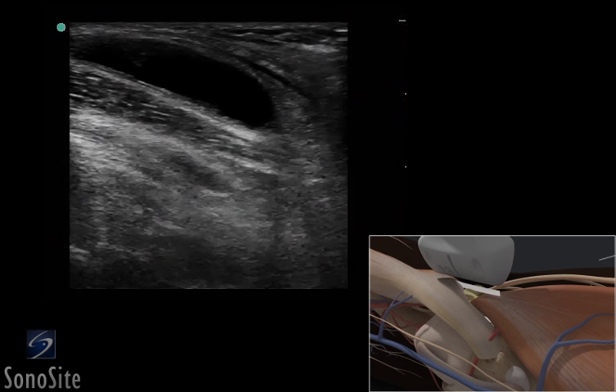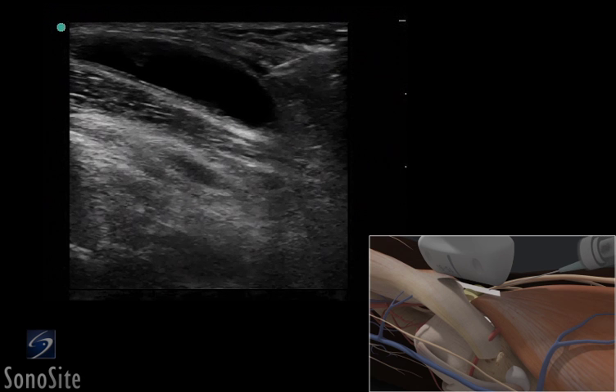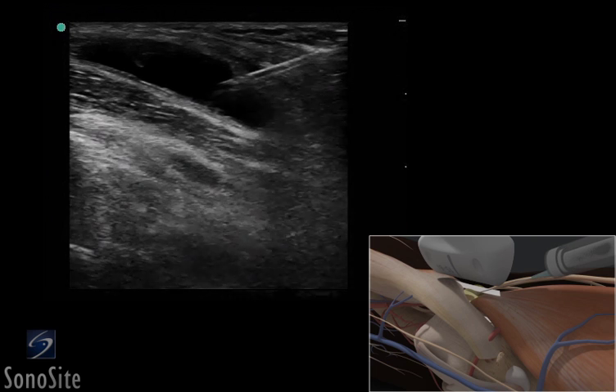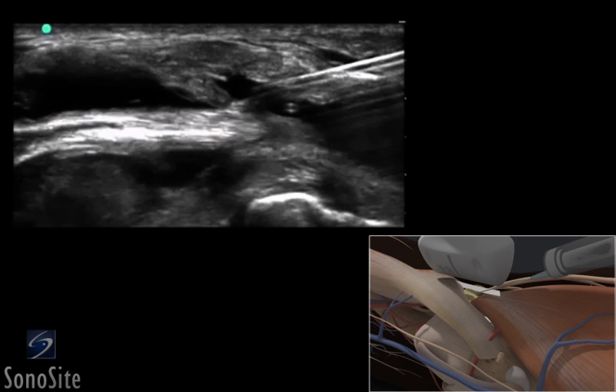The needle is inserted in the skin just proximal to the transducer. The needle is slowly advanced to lie in-plane to the transducer beam and is seen as a bright, hyperechoic linear structure. The needle is slowly advanced under direct ultrasound visualization until the tip is seen to lie within the Baker's cyst, where an aspiration can be done.